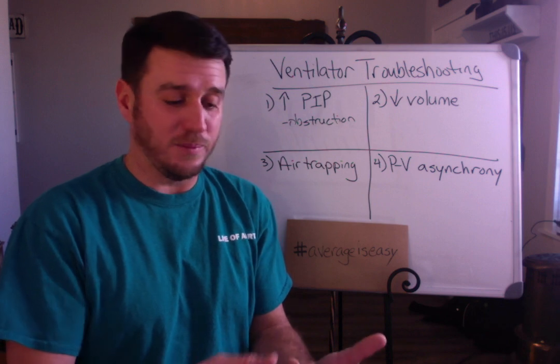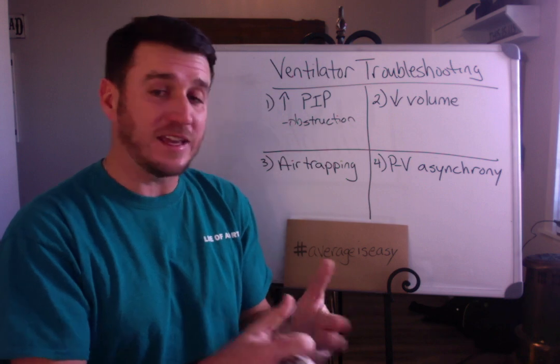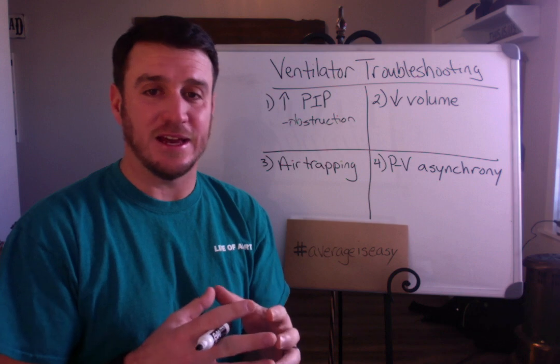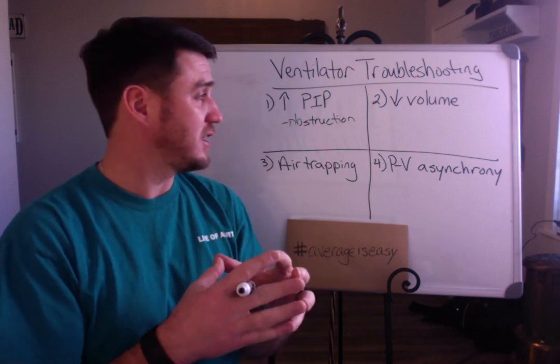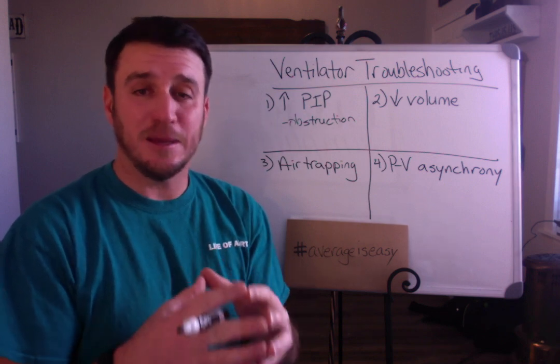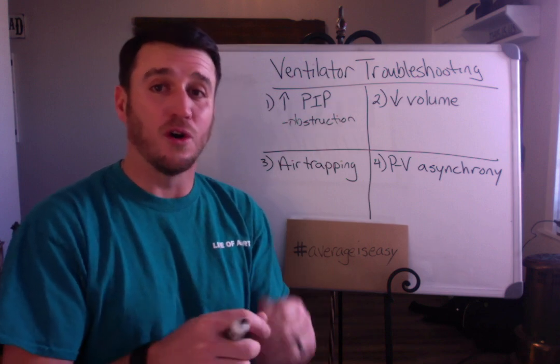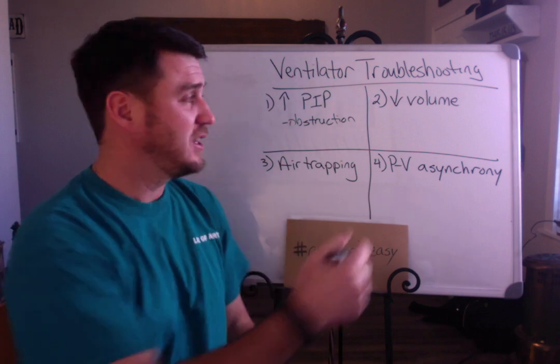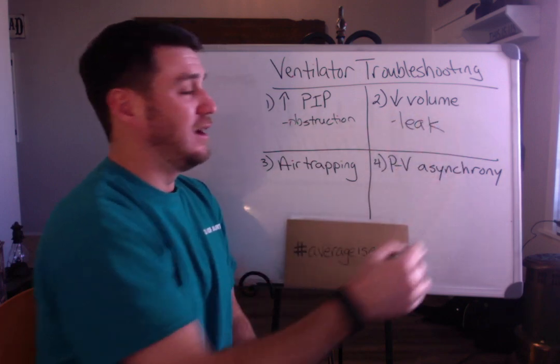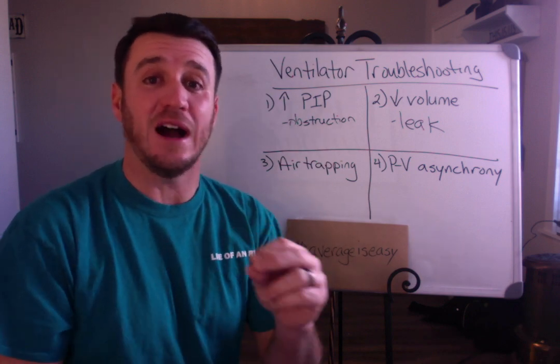Okay? Now, point number 2 here is, what if I get a situation where I'm having decreased volume return, whether it be tidal volume or minute volume? Now, again, we're talking volume control. You have to understand that. With volume control, we're talking decrease in volumes. Typically, when a patient presents with a decrease in volumes or a sudden drop of volumes, you're thinking a leak.